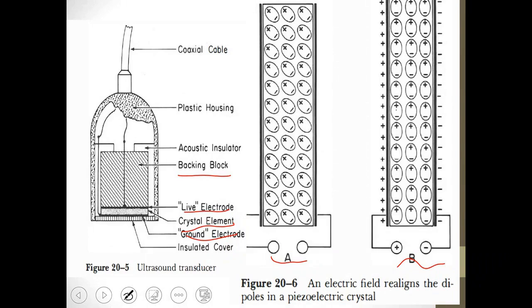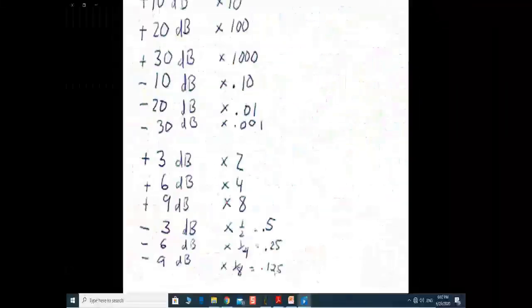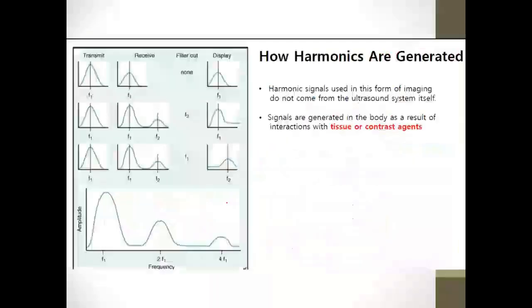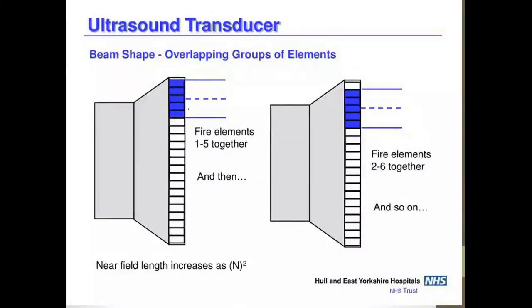The probe? Okay. But the probe itself is not just one crystal inside. I want to show you an image. For example, here is the shape of the probe.